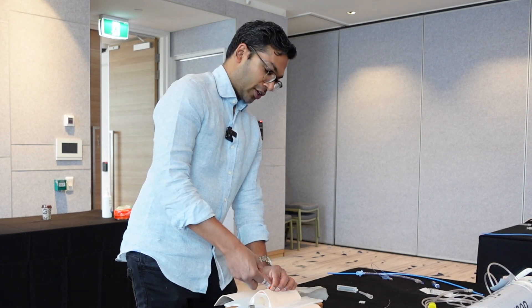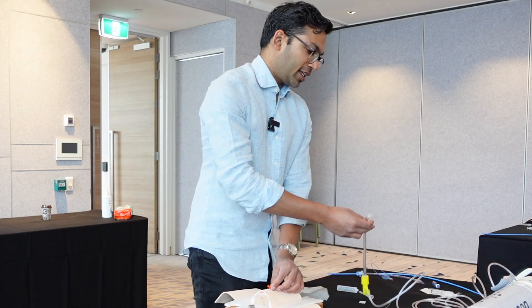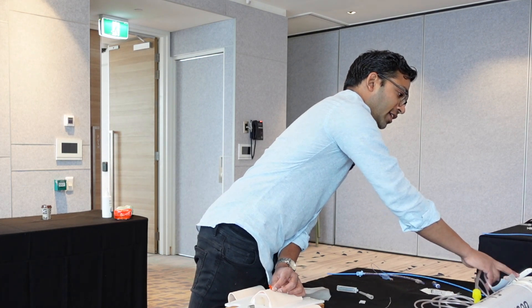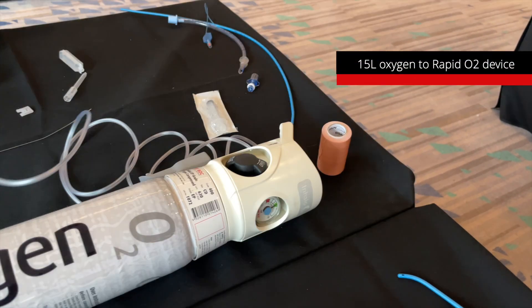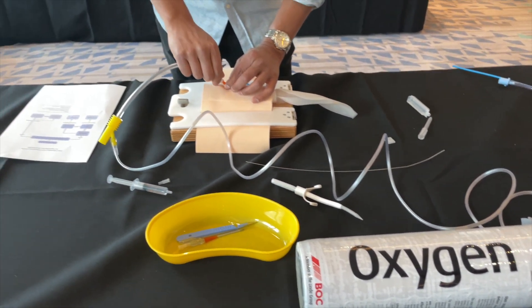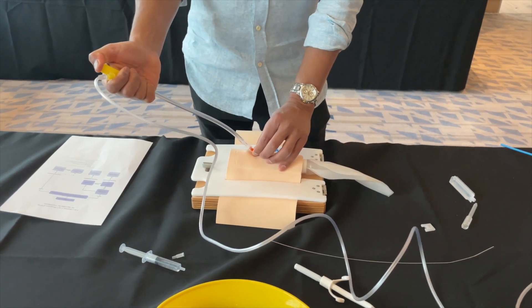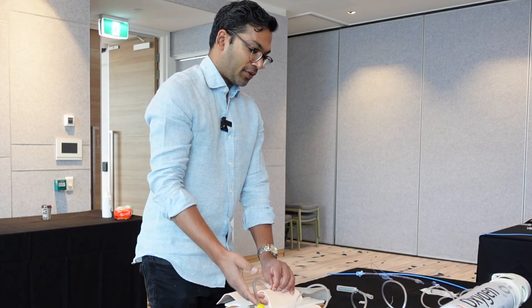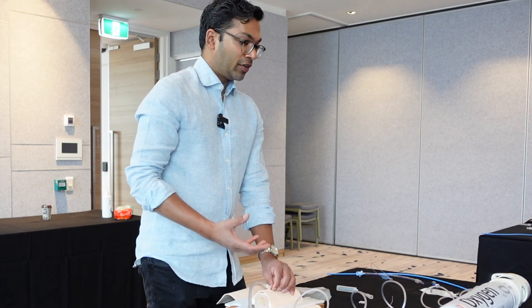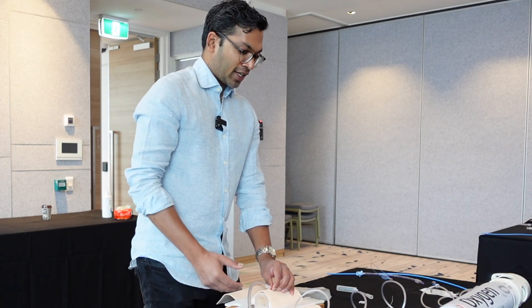Once you've confirmed the correct position, you need to jet ventilate — never letting go of the cannula or getting someone else to hand you the equipment. Get someone to connect the Rapid O2 device to the oxygen cylinder and turn the oxygen on to 15 liters per minute. I then connect this via Luer-lock connector and insufflate for four seconds. Four seconds at 15 liters per minute is about a liter of oxygen — that's probably all you need to get a rise in saturations and keep your patient safe.